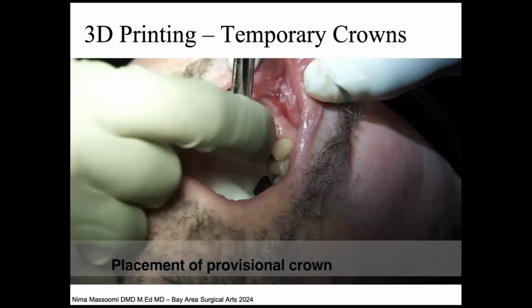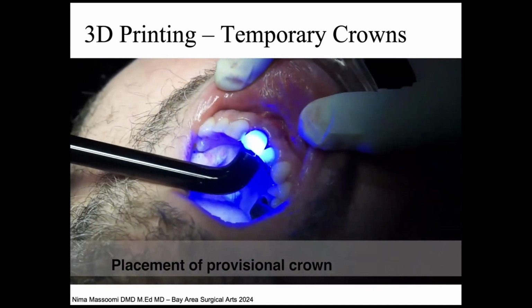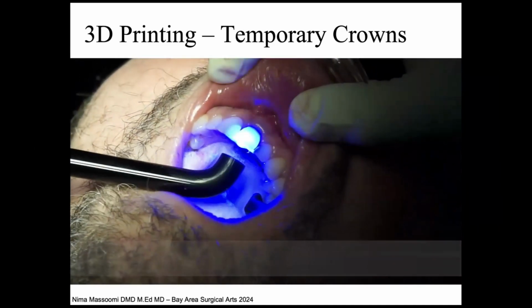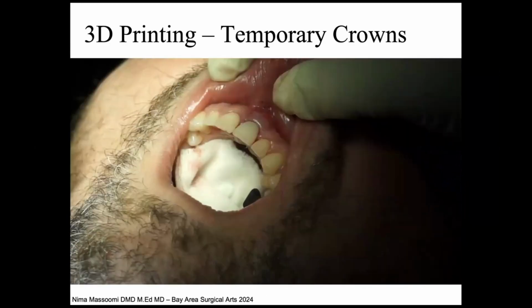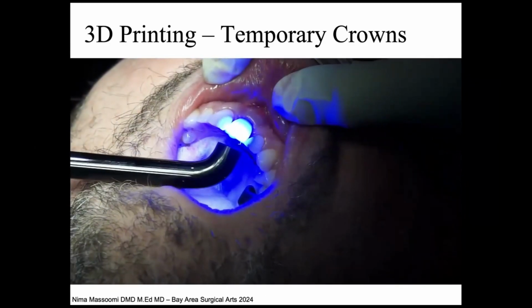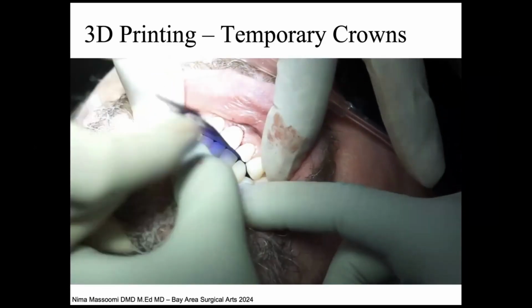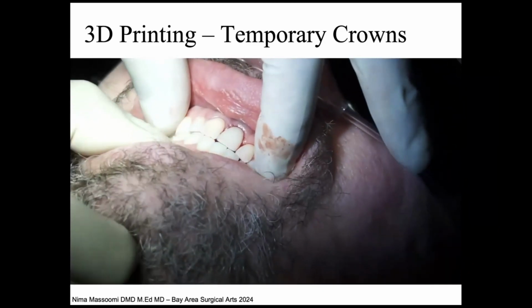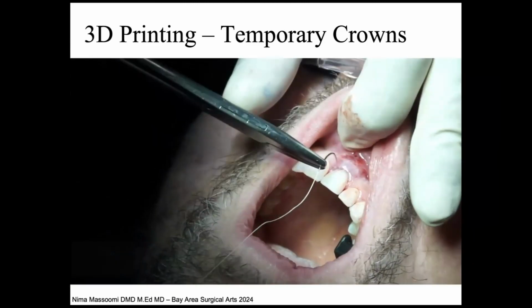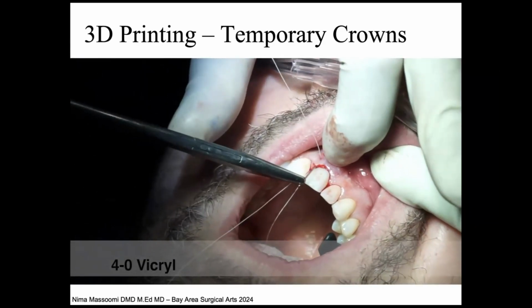And again, I stress to all of you, please, please, please torque your final crowns, whatever it is you put on an implant, always torque them down, okay? You won't believe the number of times we get patients coming in with bone loss, peri-implantitis, because the crown was not torqued down. I've even had patients who, when they went to the general dentist for the final crown impression, the healing abutment wasn't torqued down, and they swallowed the healing abutment.